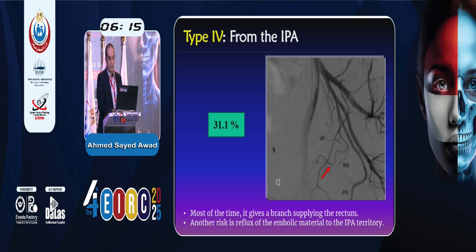This is the superior gluteal, the first one, the inferior gluteal, then the internal pudendal. In this case, the obturator arises from the posterior division. This is the easy access for the prostatic artery, but carries a risk of non-target embolization to the rectum and the internal pudendal. The middle rectal artery arises from the internal pudendal with the prostatic in many cases of this.